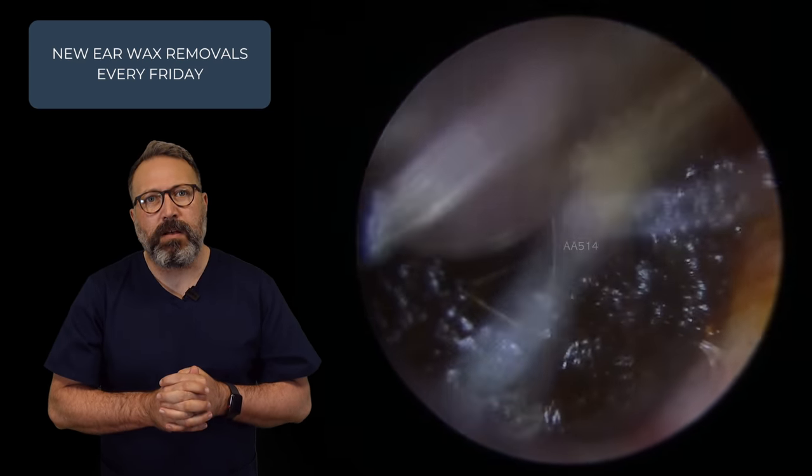We're just getting to the wax now behind that skin — it was a little bit more skin. You can see the texture is totally different; that front section is very, very wet. Look just beyond the suction tube — you'll see a much drier, darker type of wax that's been in there a little while. Out that comes. You can see that skin lifting off the canal wall as we're going in — this has almost been cocooning this wax and holding onto it really, really tightly. And sometimes when you do unplug a piece of wax from the canal wall, especially if it's been forming a really good seal, you'll get this sudden release of all the warm, moist air that's been sitting behind it, and you'll get this kind of humid misting to the endoscope. You can see a little bit of wax that just stuck to the camera — let's give that a good clean. Now we can get a good look. That debris is really plugged in there — really, really plugged.